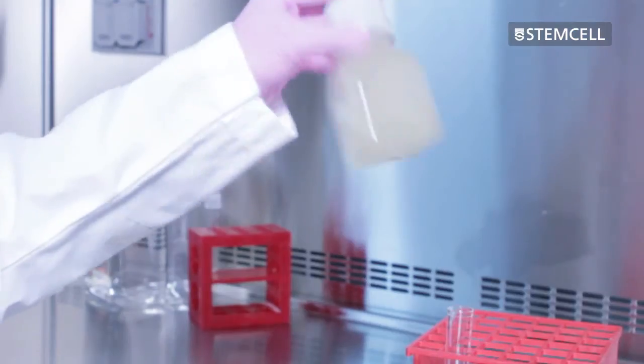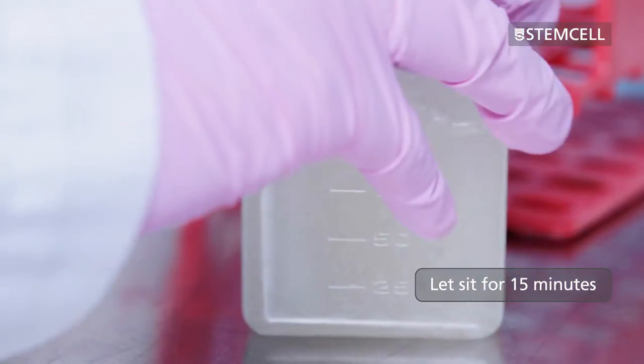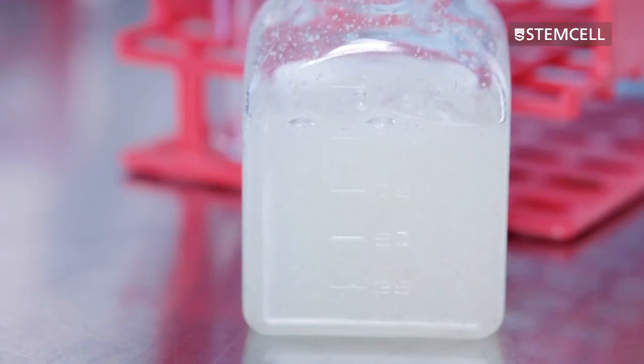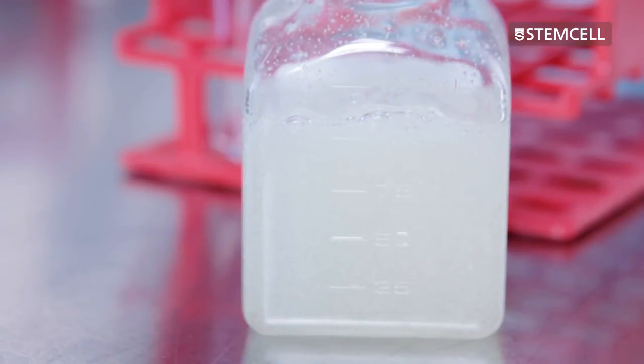Mix the contents of the bottle thoroughly and let it sit for at least 15 minutes to allow the bubbles to rise to the top. The cells are now ready for plating.